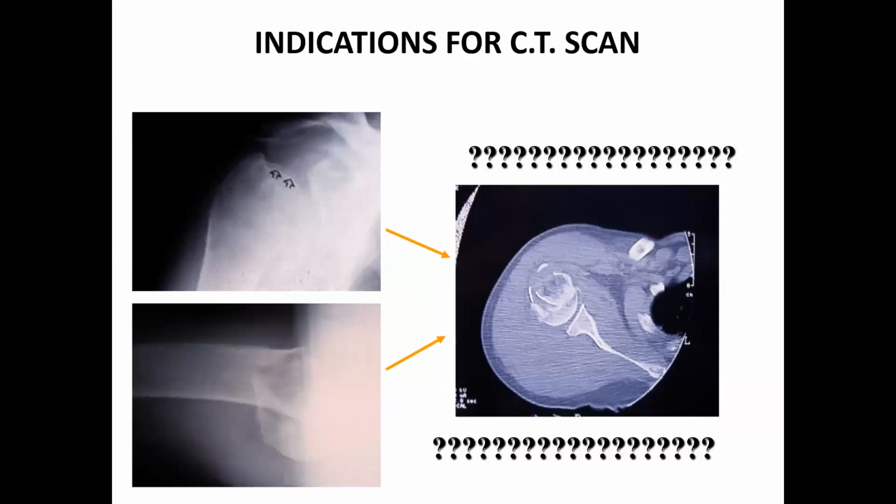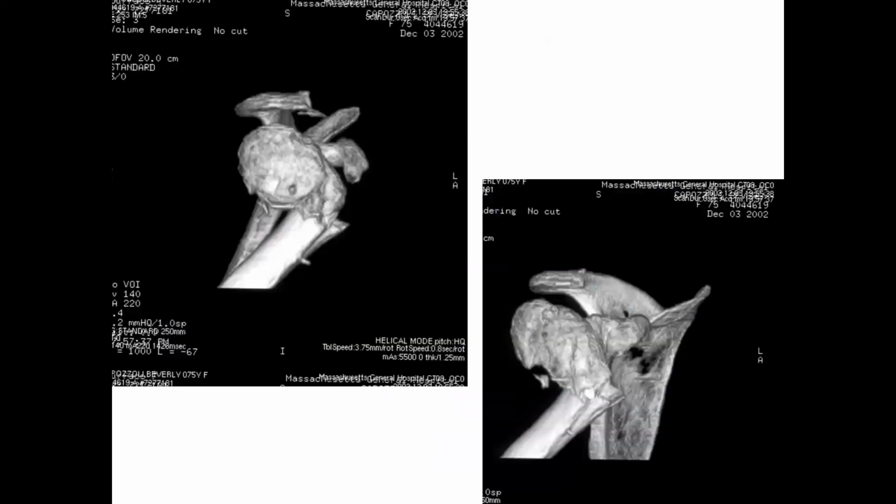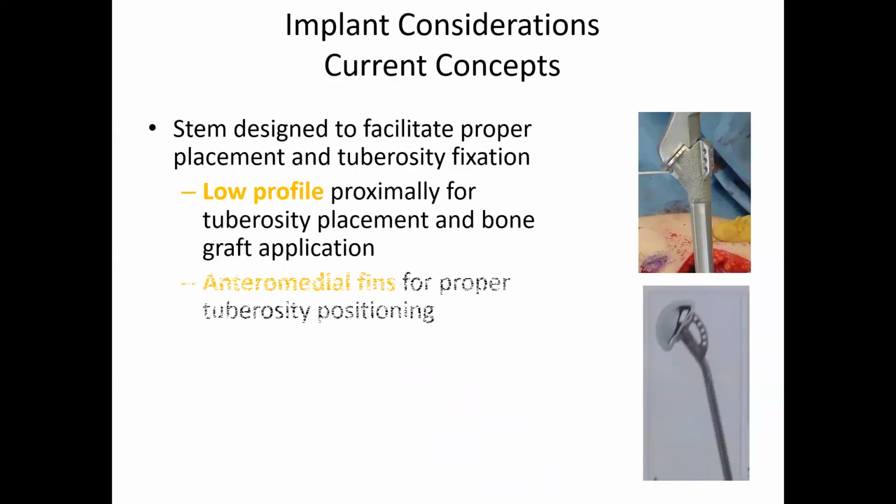And then, of course, this is followed by a CT scan because in most of the cases, it's very difficult to see the configuration of the fracture and the degree of comminution and the extent and all of that. So we need to do a CT with 3D scan to have better information, a better idea of this fracture and how we're going to treat them. As you can see here, the 3D reconstruction of a fracture.